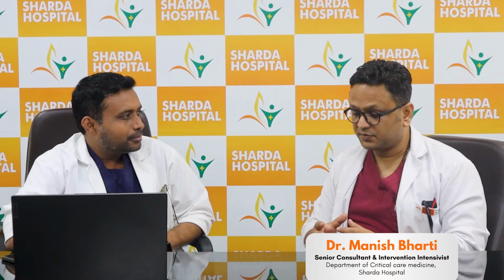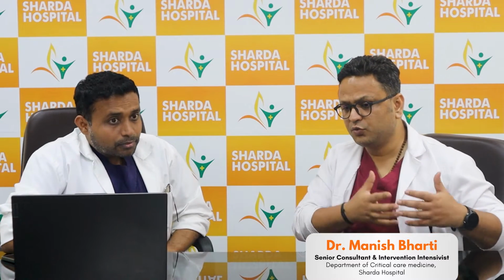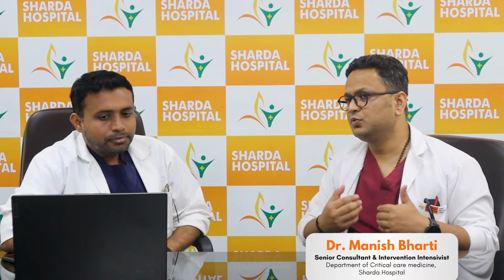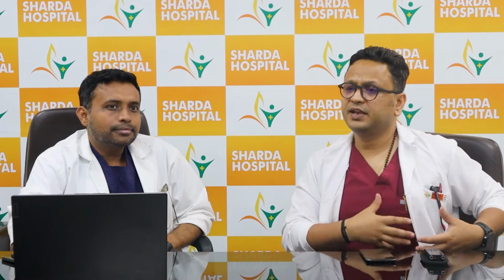Because this is something which comes to us by default. Okay, let's say why we are saying acute care bronchoscopy and what are those acute things. Majority of the times when we scope the patients, the patient is retaining secretions. When I'm talking about secretions, it's basically the phlegm, the sputum, which they are not able to expectorate out. That leads to mucus plugs, impaction syndrome, and their lungs get collapsed, right? They have atelectasis. So we are talking about mainly those cases.